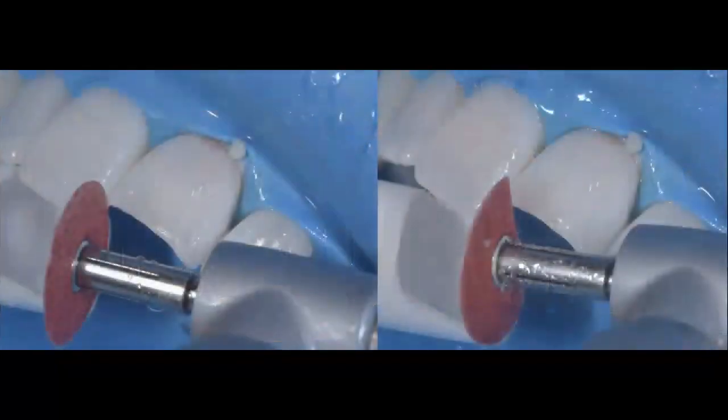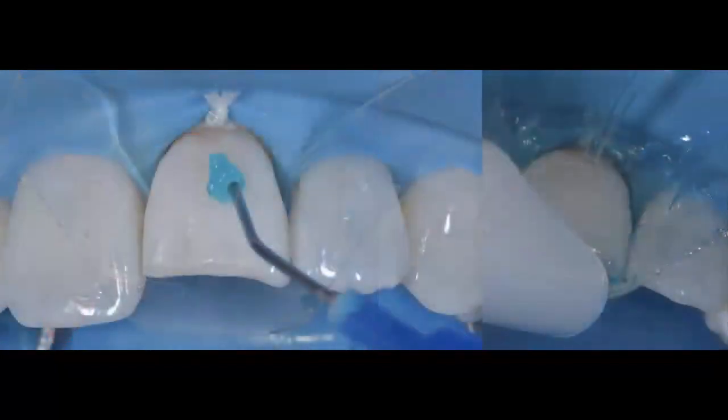So after isolation, I'm going to make sure that all the line angles of the fracture area of the tooth after removing that old restoration were nice and round. I don't want anything sharp. There was no enamel reduction. Again, there was no need for it because the tooth was slightly more lingual.